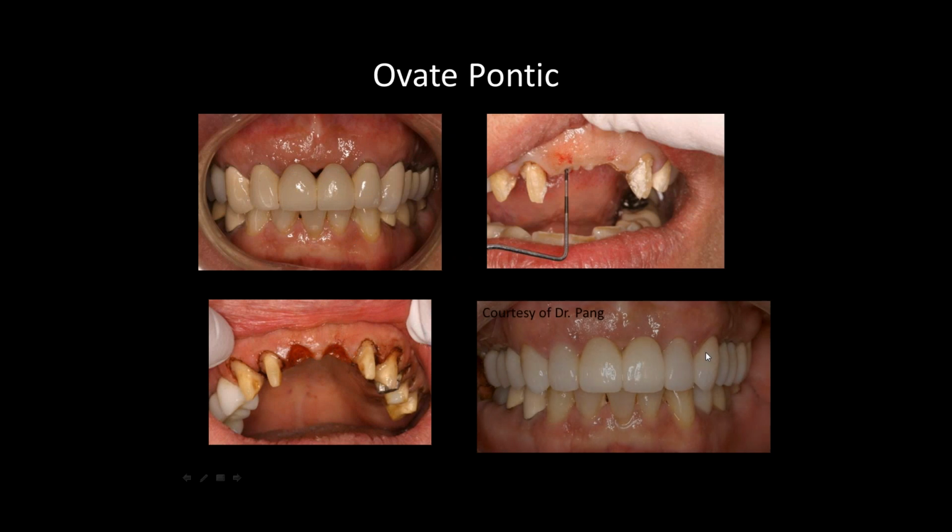Hey, Jay, this is... yes. On that last case, there were two other questions. Sure. First one was, do you turn down the illumination to see the red aiming beam better? And the second one was, do you reapply topical for a lengthy procedure like that?